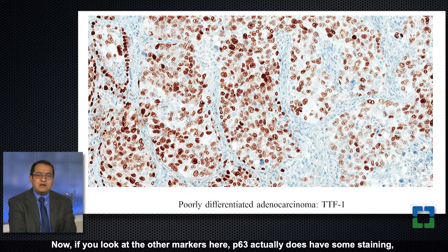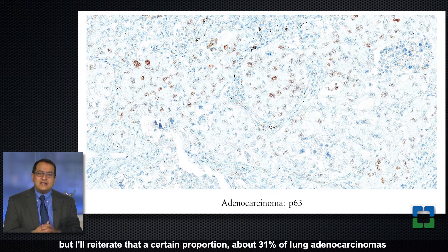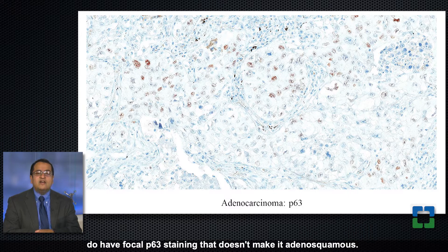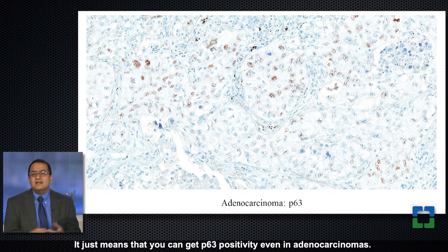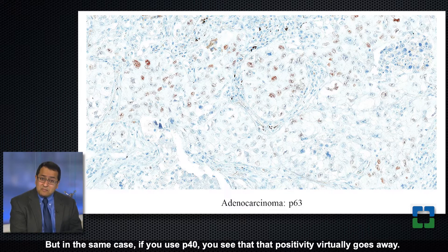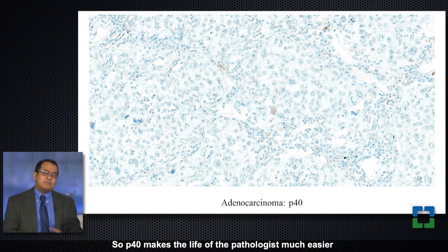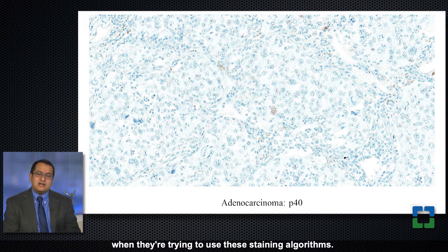If you look at the other markers, p63 actually does have some staining, but about 31 percent of lung adenocarcinomas do have focal p63 staining. That doesn't make it adenosquamous; it just means you can get p63 positivity even in adenocarcinomas, especially this kind of focal patchy positivity. But in the same case, if you use p40, that positivity virtually goes away, so p40 makes the life of the pathologist much easier.